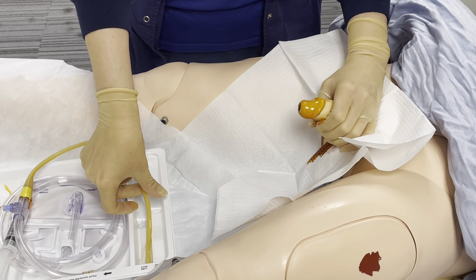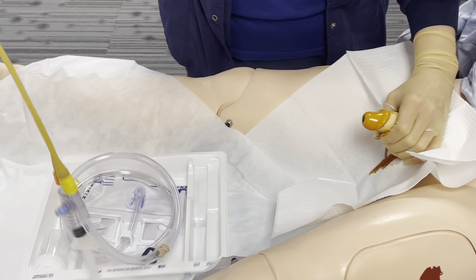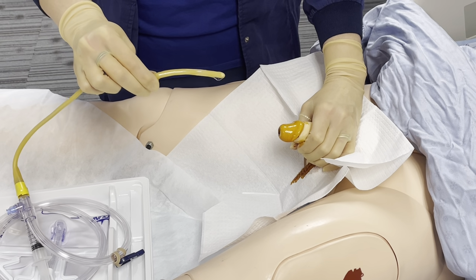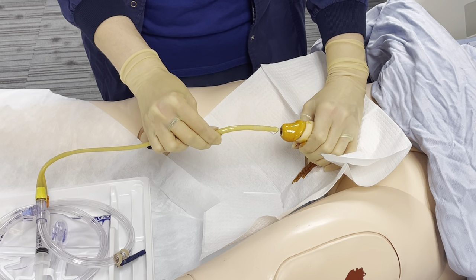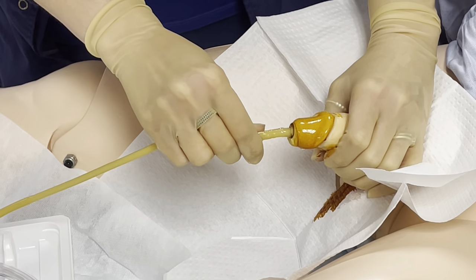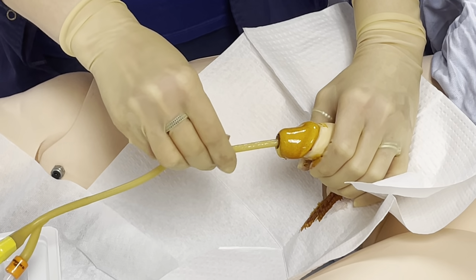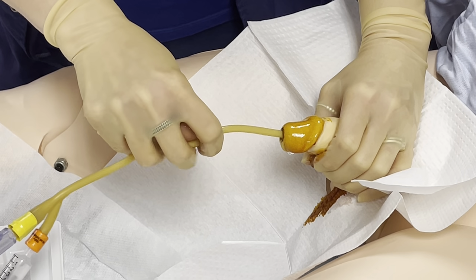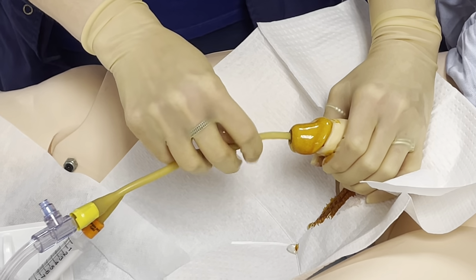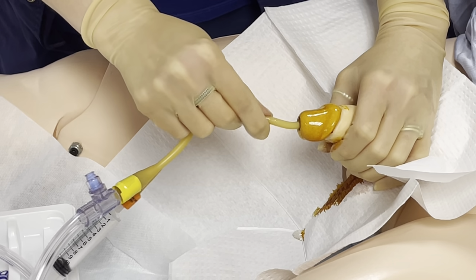I'm gonna grasp the catheter. It is very slippery, so you wanna make sure you have control of it. There we go. I'm gonna be careful that my insertion hand, my sterile hand, doesn't touch the penis. And I'm going to insert the catheter without touching anywhere else except for the urethral meatus. I'm going to insert and simply walk my fingers back without letting go so that it doesn't fall out until I see urine. I see urine. Oh, great. I'm going to advance it 2 more inches.